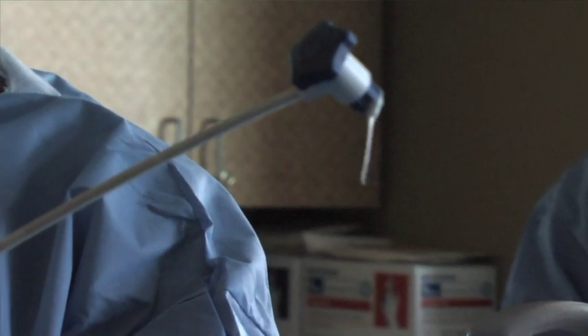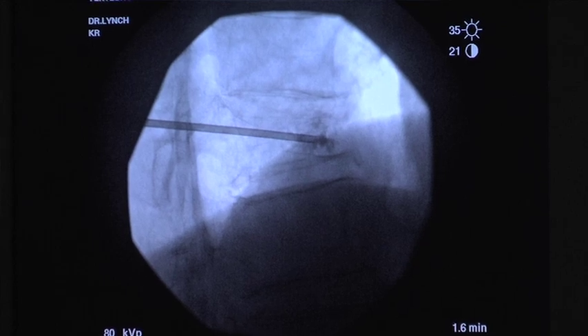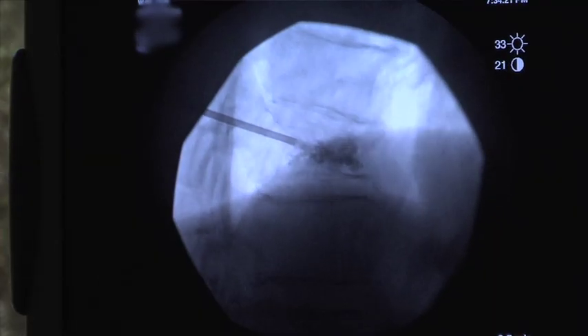This is at the consistency of toothpaste. Depending on the location of the fracture, anywhere from 2 to 6 cc's of cement is delivered into the vertebral body. As the cement begins to harden, it forms a cast inside the vertebral body. By stabilizing the bone, it prevents movement and thus stops the pain.